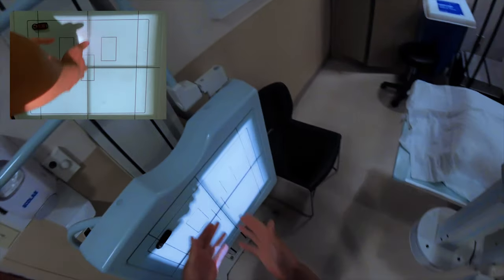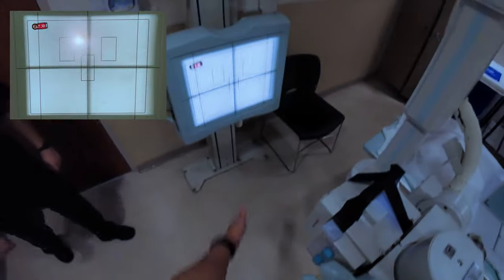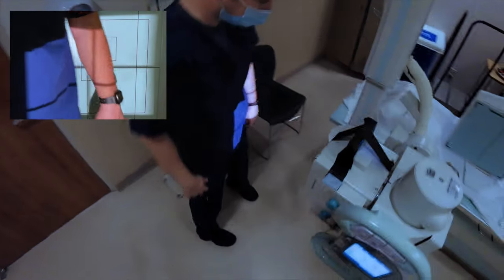All right, sir, so that's what we're going to have you do. I'm going to have you stand over here. Your back is going to be against this board. You're going to be facing this way. I'm going to get everything lined up to your height, and then once I do, you're just going to kind of pigeon toe here, and then I'll take the image, all right? So go ahead and stand there, back against the board, please.